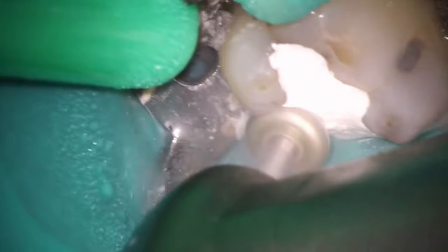We'll start off as we always do by taking the tooth out of the bite. The clinic they work at is a little bit behind as far as crowns, so I'm actually being a little more aggressive here with the occlusal reduction. I do anticipate some eruption because they're about two to three months out from getting crowns done. I base how much I do on where they're coming from and the situation. I'm also trying a stabilization feature — if you see some weird ripples, it's supposed to make a difference.